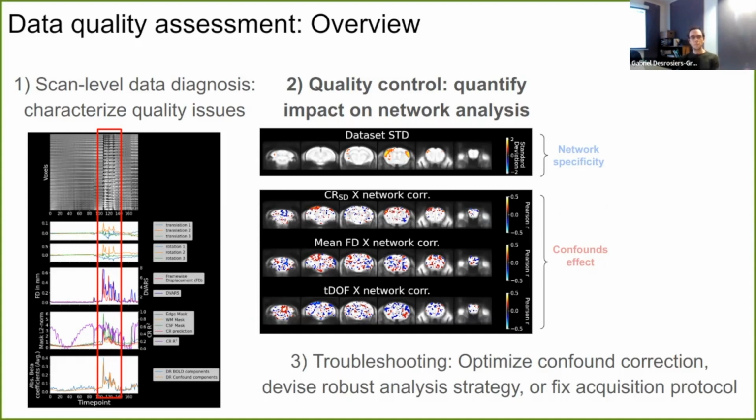I wonder if there's an interesting way to look at some of the internal steps here, to see if there's greater motion in one group of mice than the other, or in some of the parameters they need correction on. First of all, just so we know, in case that could be biasing any downstream results, but also as an intermediate outcome.